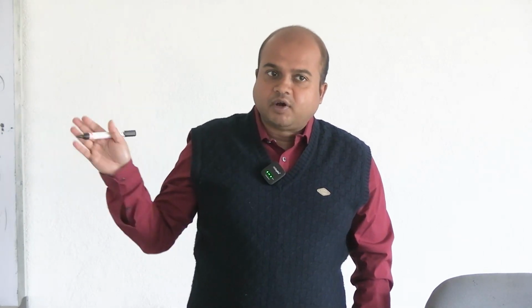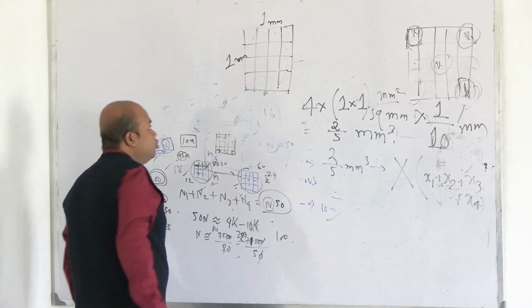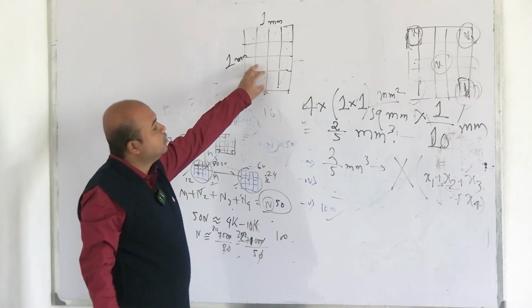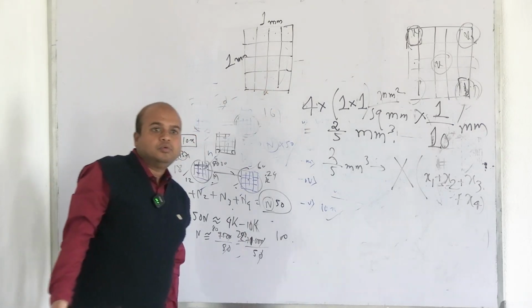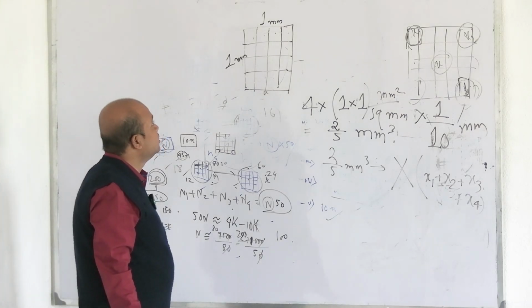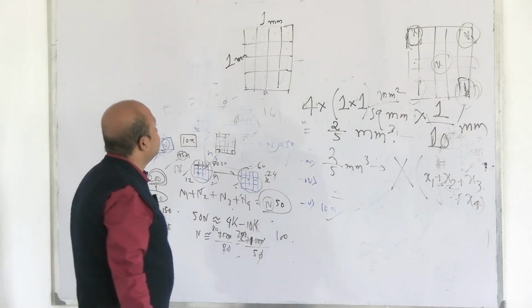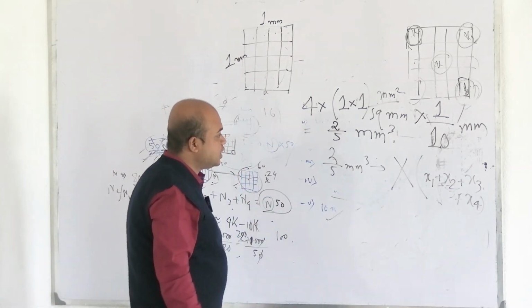In case of RBC, after this division there is another type of division, because the number of cells will be still huge. If we just, that will not be sufficient, perhaps only two divisions. So here, do you get it? So please interact, at least in the demonstration classes, otherwise it will get more difficult if you don't understand anything and just try to mug it up.